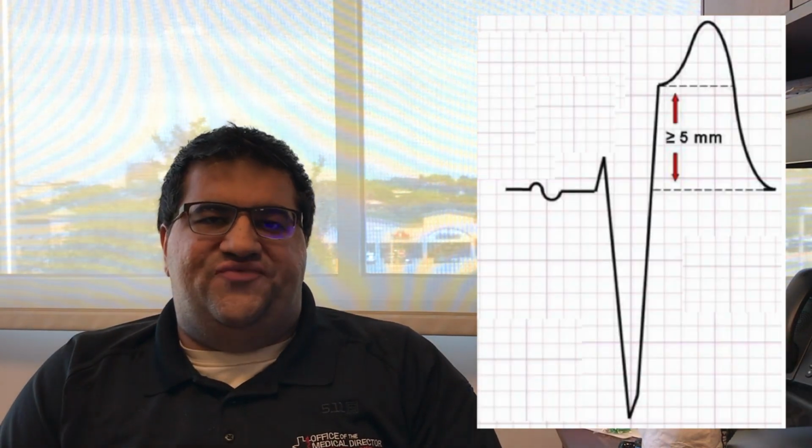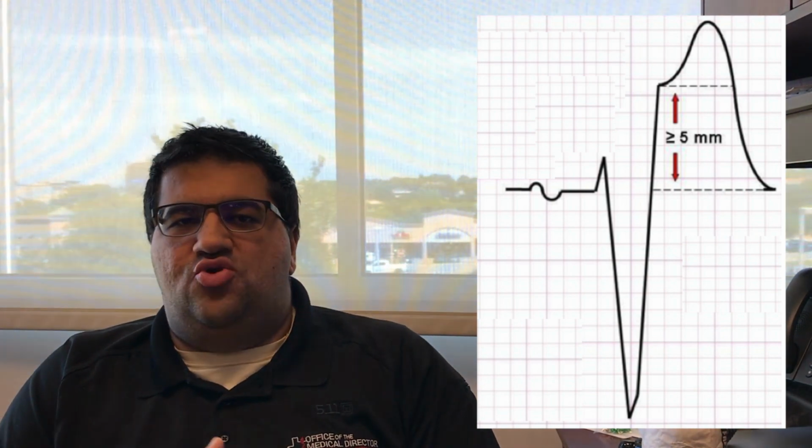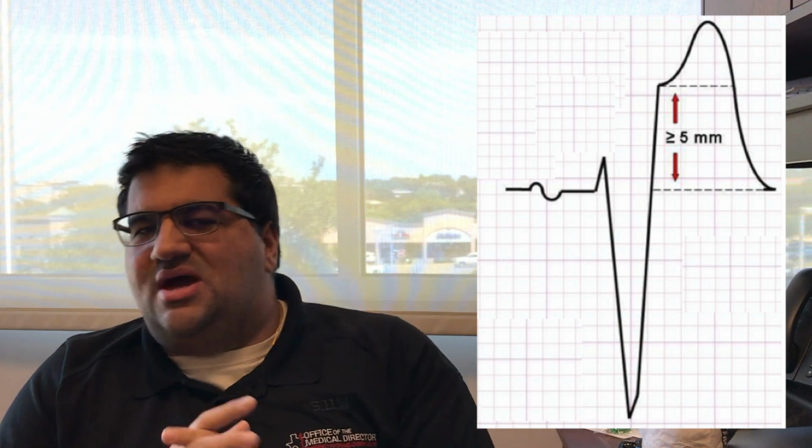So if you have a very wide change to your ST segment in the opposite direction of the QRS, so again, V1 to V3, you've got big downwards going QRS complexes, you've got a really tall ST segment. They say over 5 millimeters or one big box, or more specifically, greater than 25% of the height of that whole QRS complex, that's also pretty significant for a STEMI. It's not as good as concordant changes, but it's still pretty dangerous.